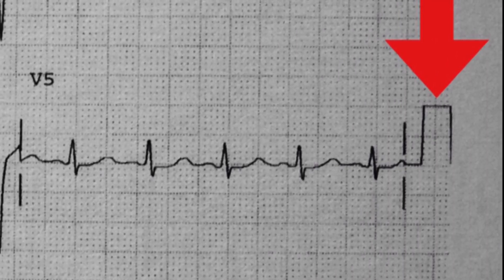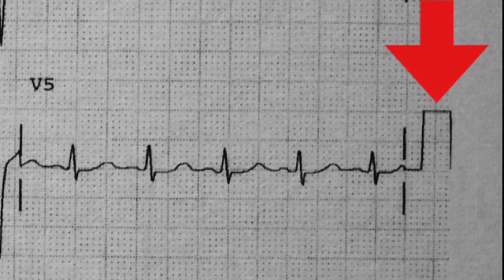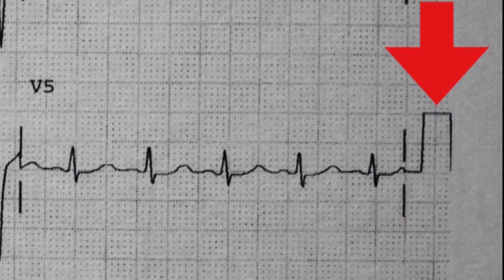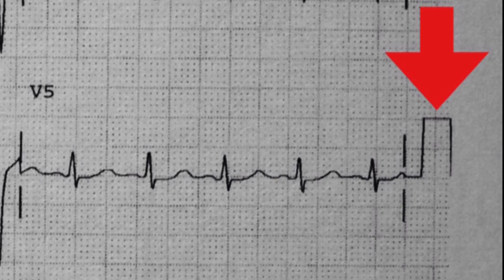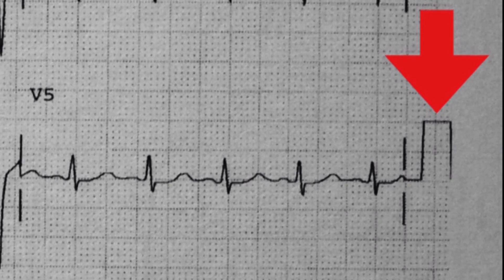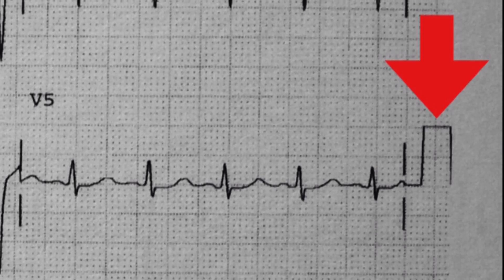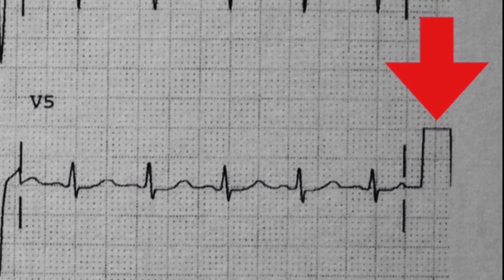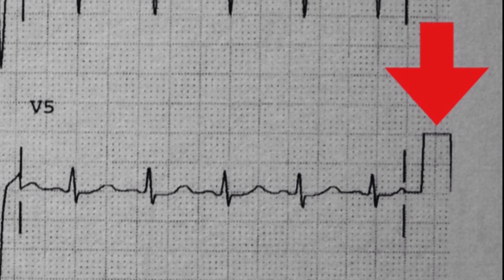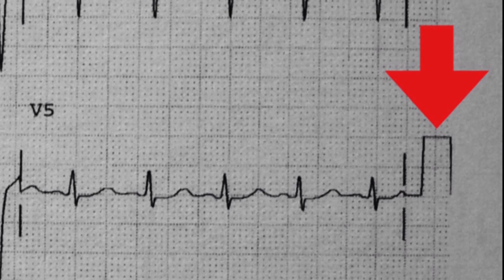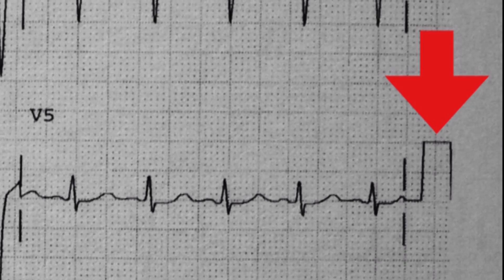Standard calibration is also important — if your calibration is not set right, your rhythm interpretation may not be right. Standard calibration is 10 millimeters vertically. Each small square represents 0.1 millivolt, which means each large square represents 0.5 millivolt. By convention, ECG machines are adjusted so that a one millivolt electrical signal produces a 10 millimeter deflection.